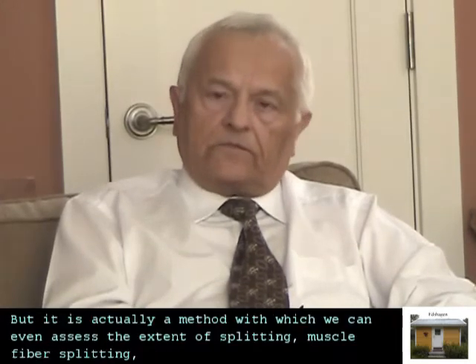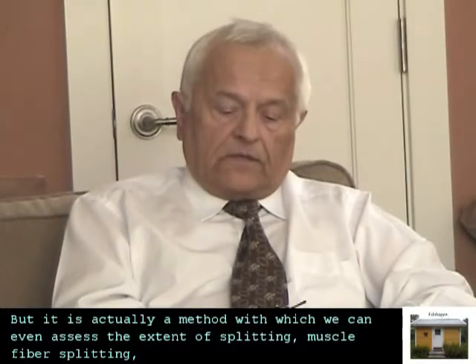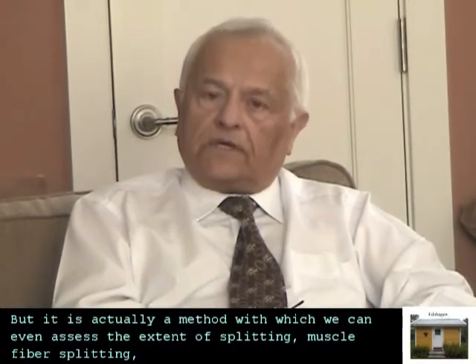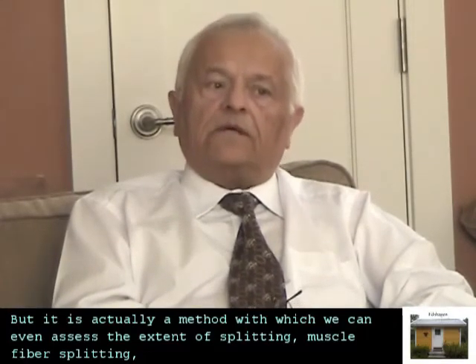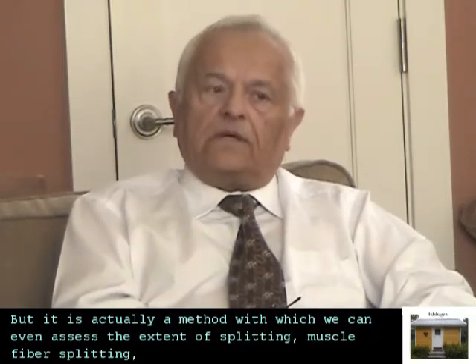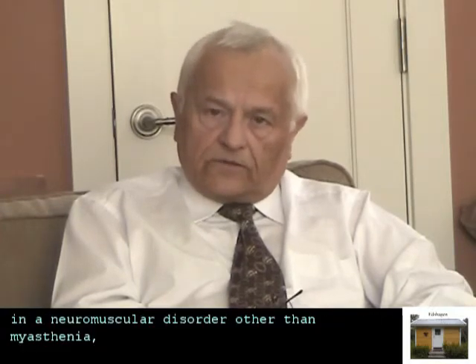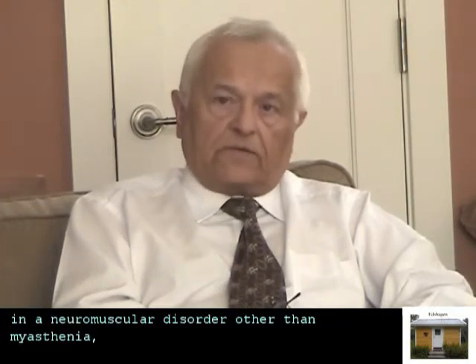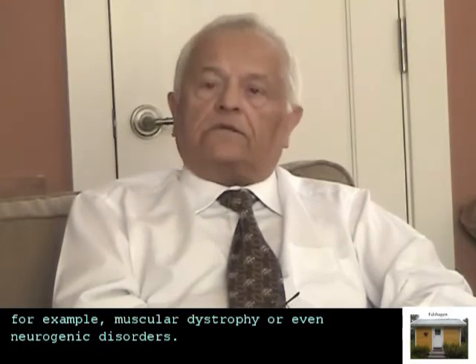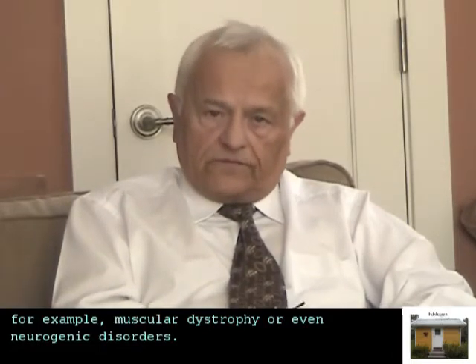But it is a method with which we can even assess the extent of muscle fiber splitting in a neuromuscular disorder other than myasthenia, for example, muscular dystrophy or even neurogenic disorders.